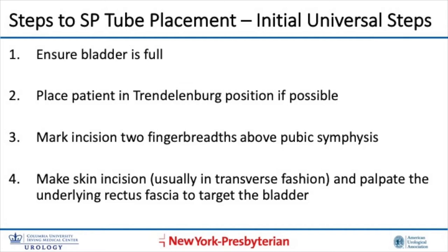In short, make sure that the bladder is full. Place the patient in Trendelenburg position, and once you're ready, mark the incision 2 finger breadths above the pubic symphysis and make the skin incision. Make sure you palpate the underlying rectus fascia to target the bladder prior to proceeding.